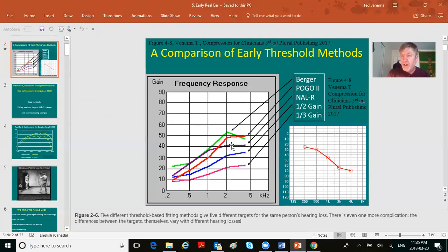Obviously then, because the linear hearing aid gave the same gain at all inputs, the gain for average conversational speech may not have been enough gain for a whisper, so the person would have to turn up the hearing aid. And the gain for average conversational speech might be too much for loud inputs, so the person would have to turn his volume down. And that's how you could detect a linear hearing aid wearer. He or she was constantly adjusting their volume controls.